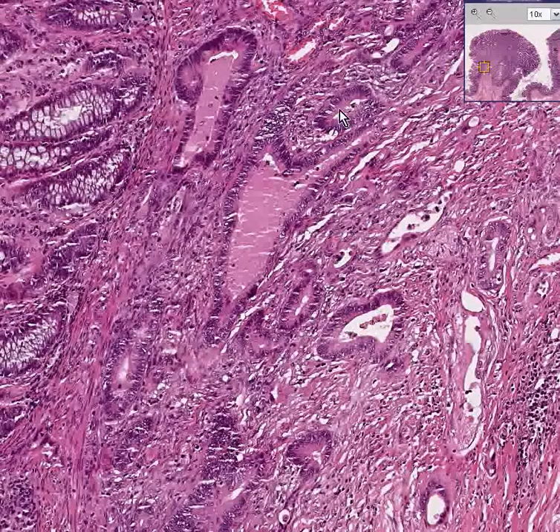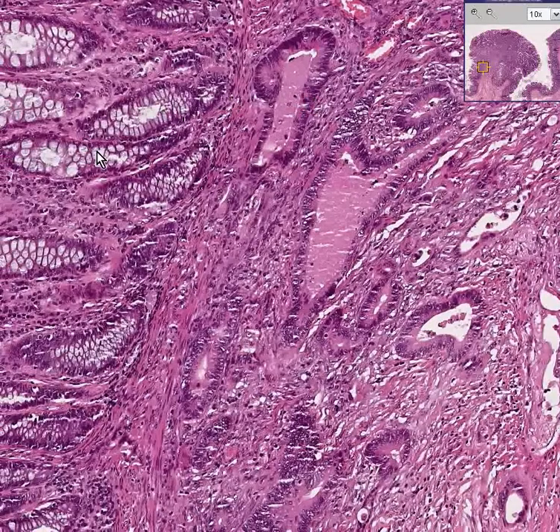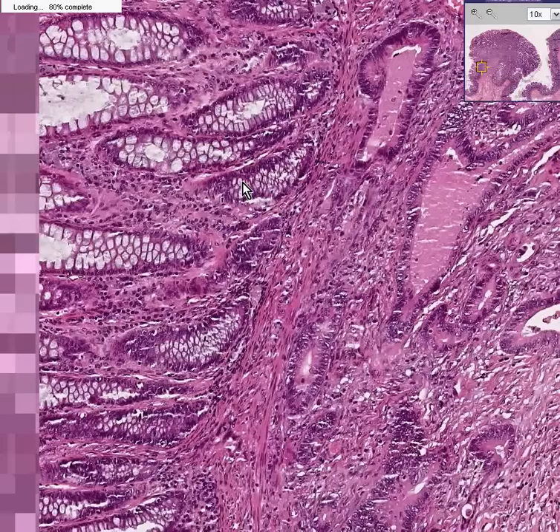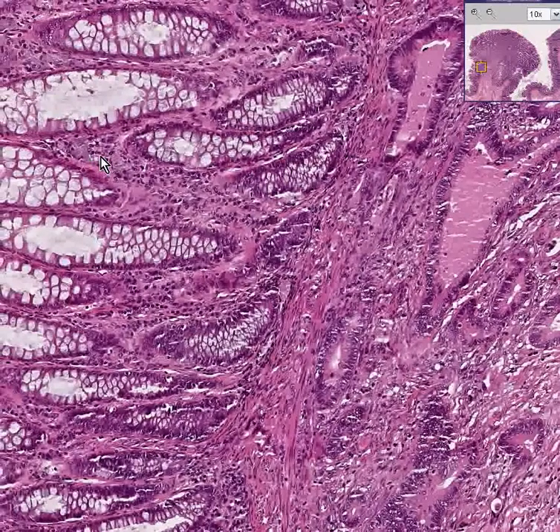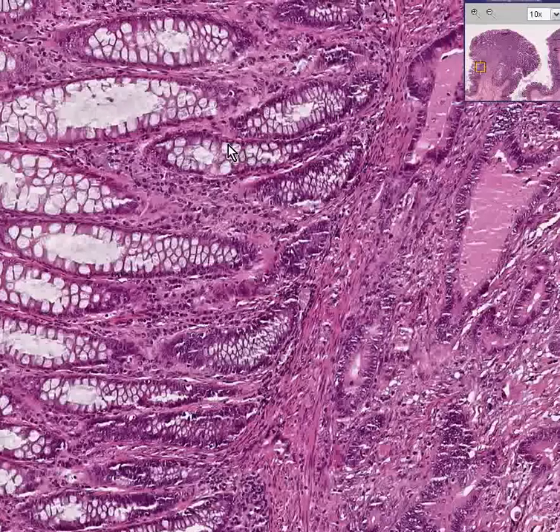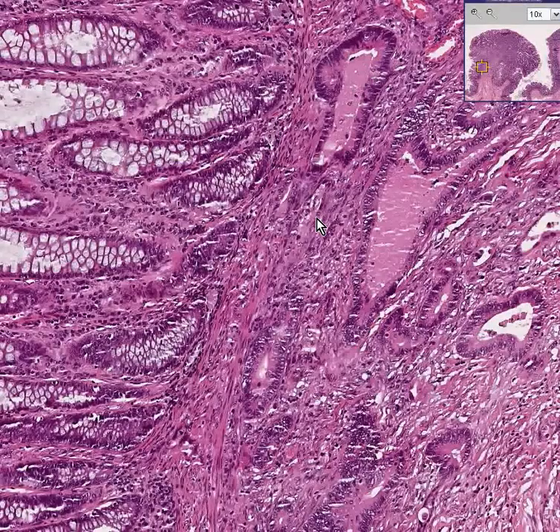These glands are dark, infiltrating, pleomorphic, with a lot of mitoses — right next door to a bunch of perfectly normal glands forming the mucosa which covers the stalk. But on the other side of the fence, these bad boys have infiltrated into the stalk.